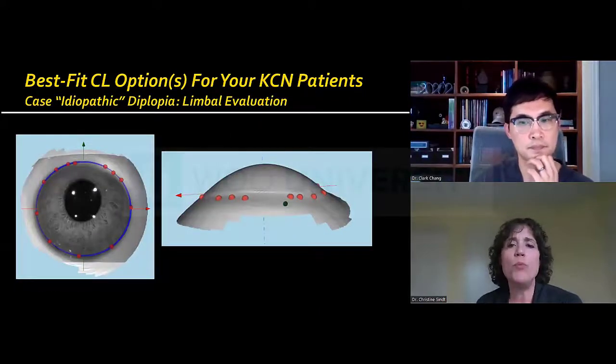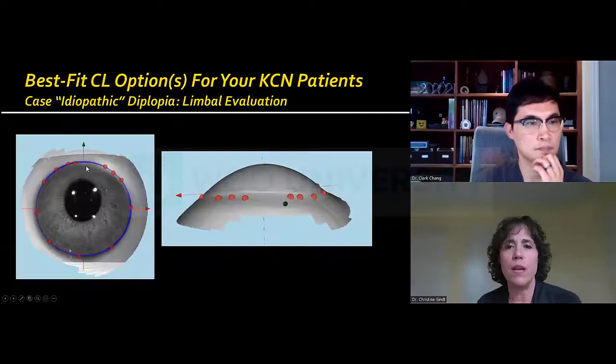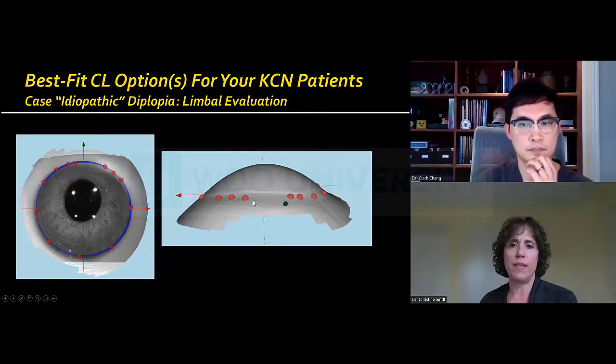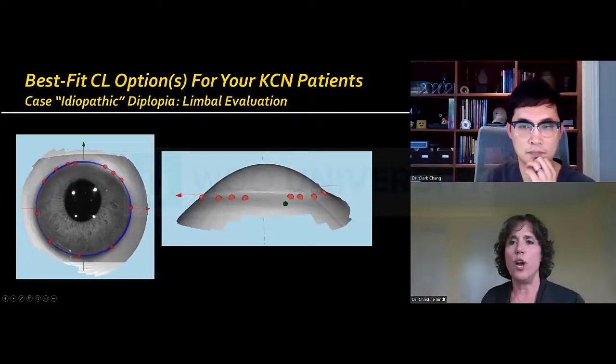Okay. And again, when we look at that area here, at that superior sclera, that next one, yeah, you can see that on the elevation map that is created in the ScanFit software, you can see where that's a superior sclera there. You can see that really interesting scleral shape. And really, you have to have the scleral shape match the scleral lens to not have an overvault or an undervault situation. Go ahead, next slide.